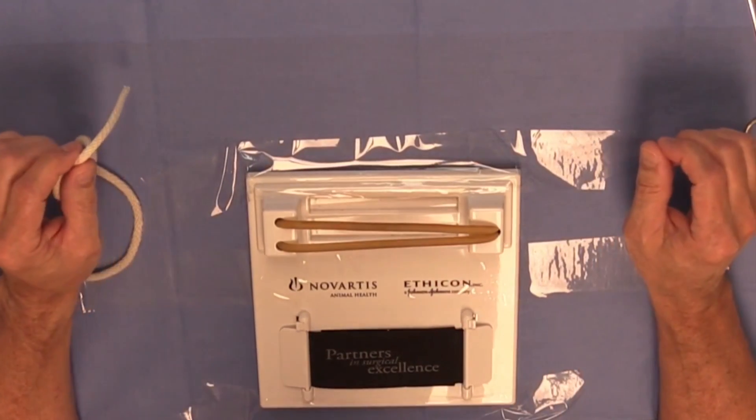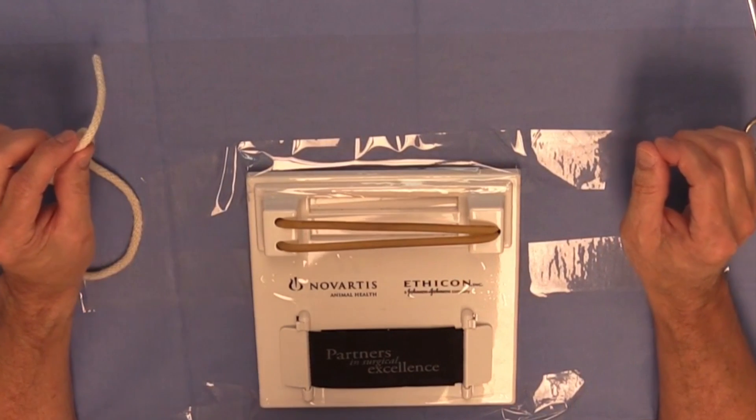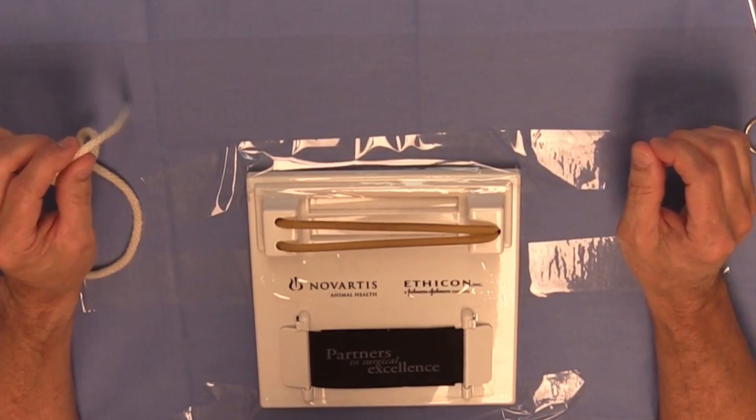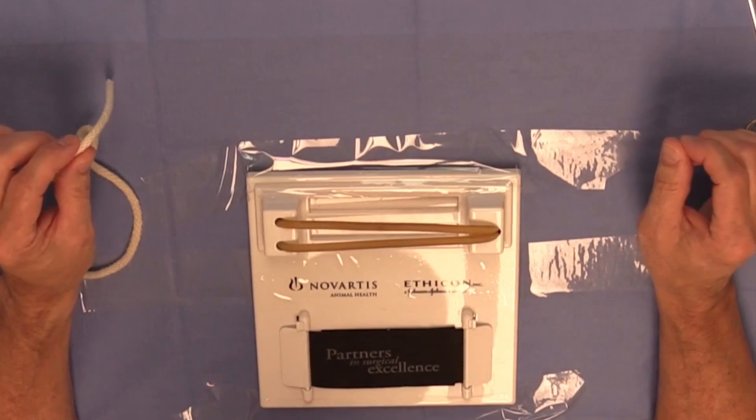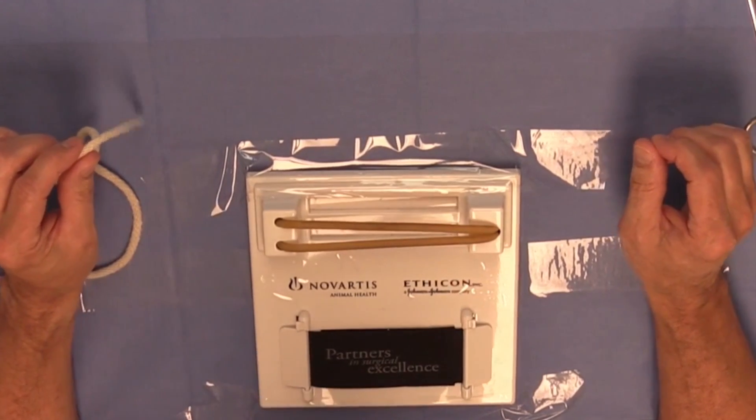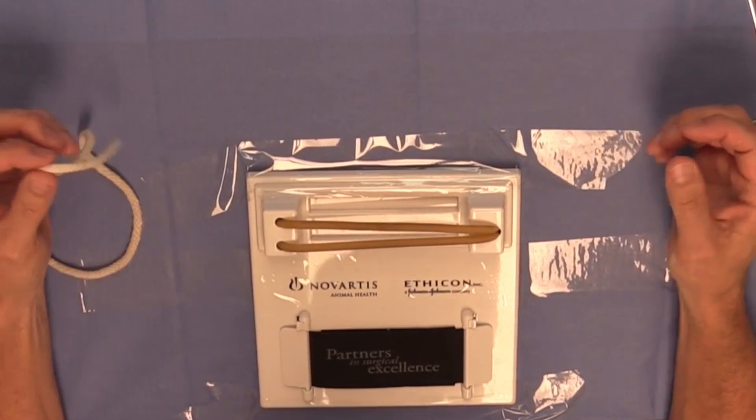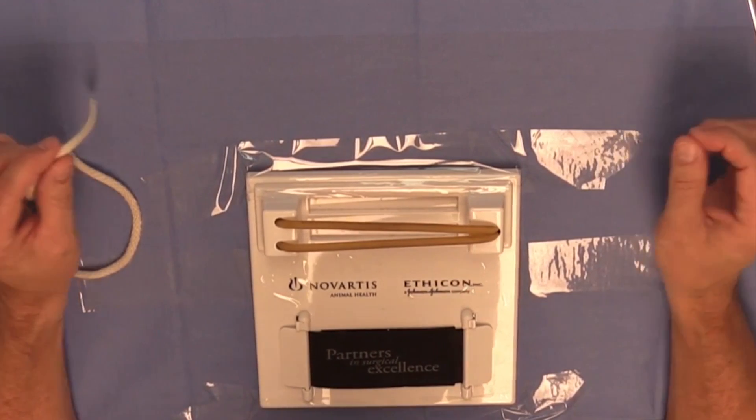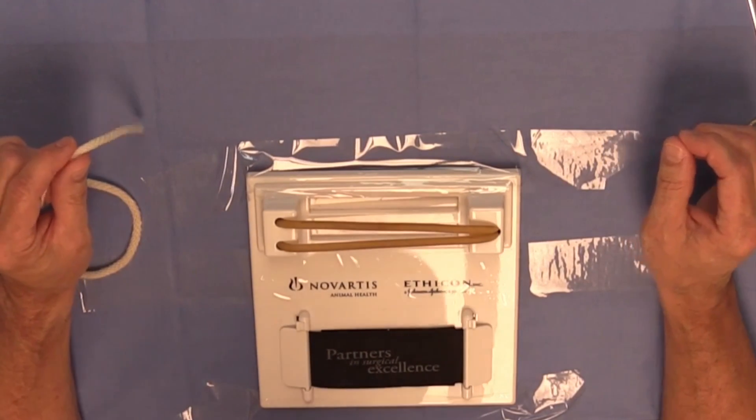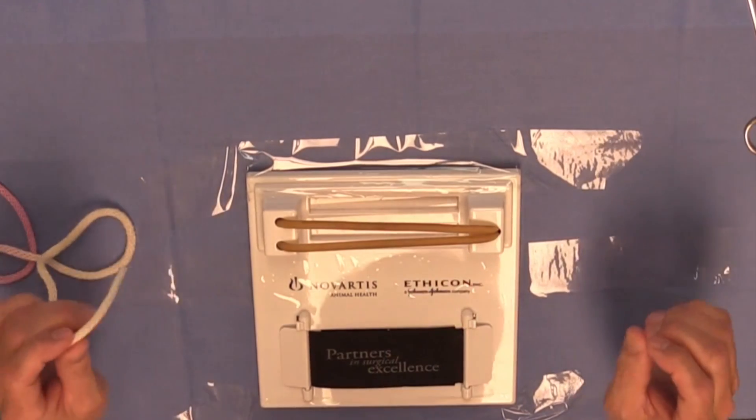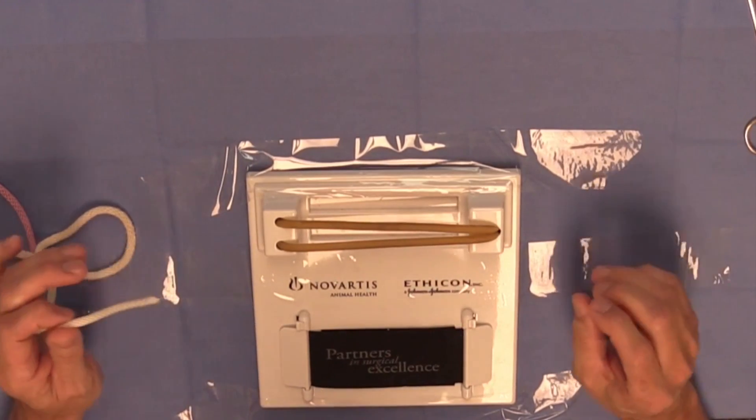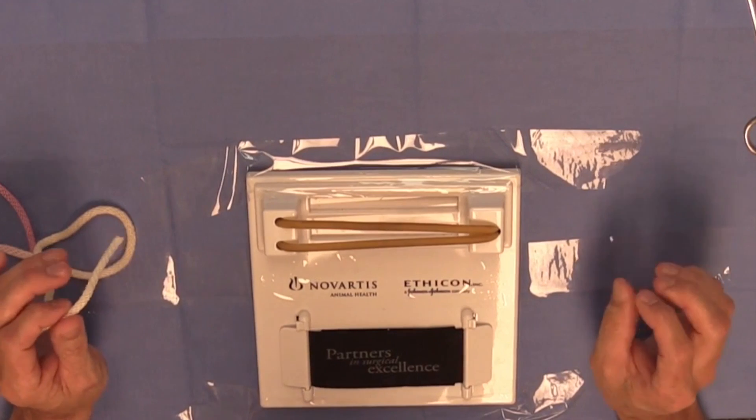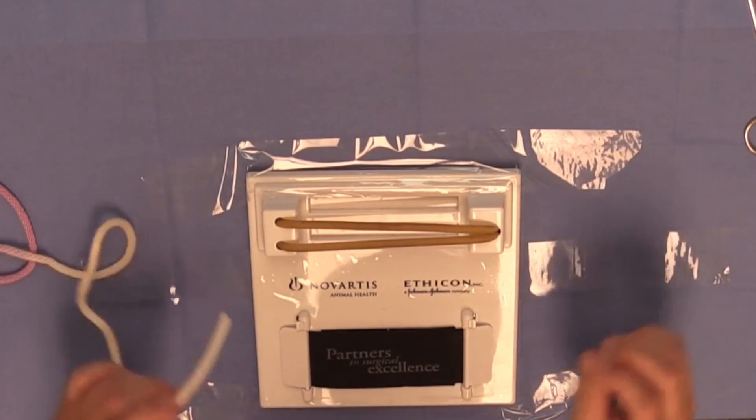I'm now going to demonstrate the surgeon's knot using a one-hand technique. I would caution you that in practice, in general, you will be using a two-hand technique to construct surgeon's knots, but there are two different ways to construct a surgeon's knot using a one-hand technique, and it depends solely on which throw of the one-hand technique that you're going to begin with.